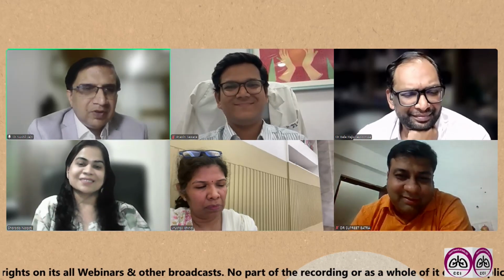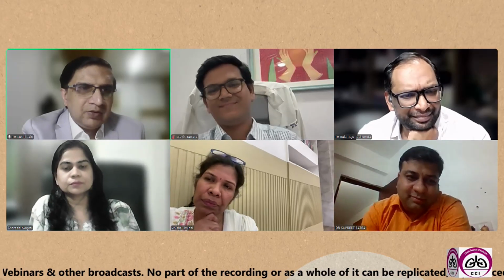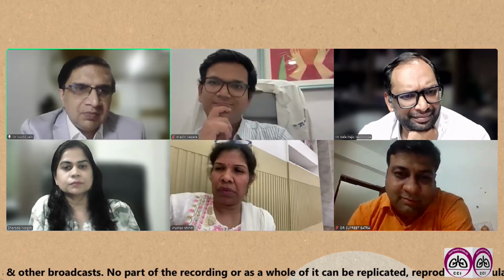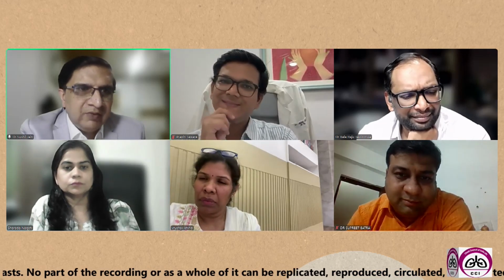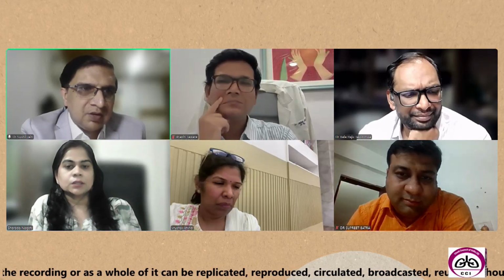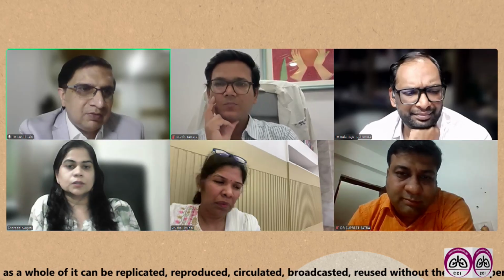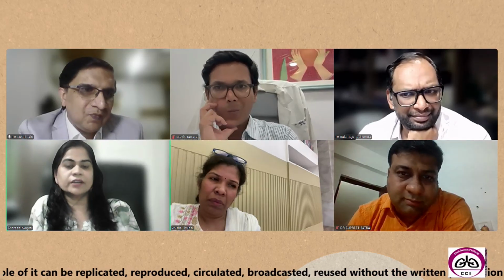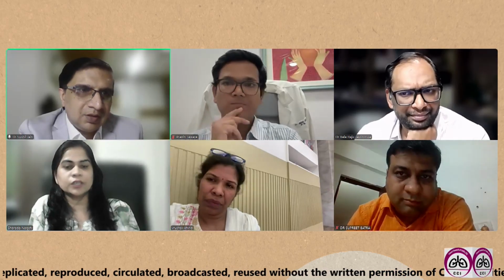Just one more important thing I want to ask you. When you are taking an EBUS sample, should we just make one slide from the TBNA aspirate and then send the rest of the tissue into the fixative for the cell block, or should we make multiple slides? What do you say? Sir, at least one air dried smear and one alcohol fixed smear. Okay, at least one of each we require.